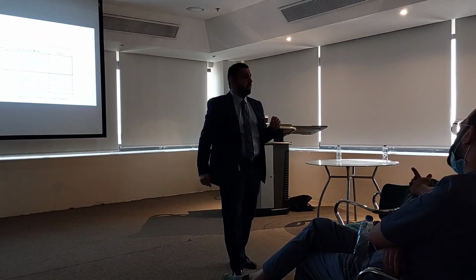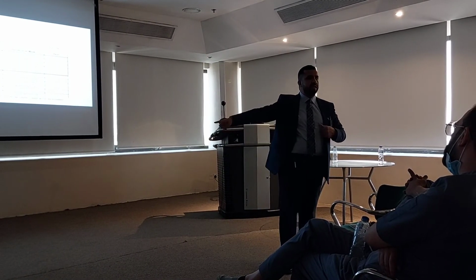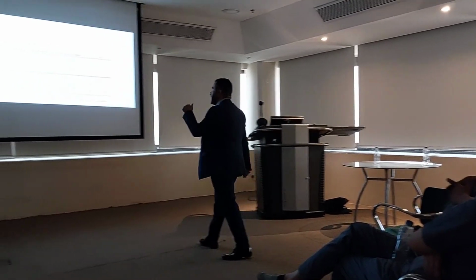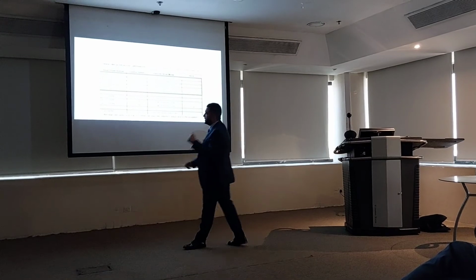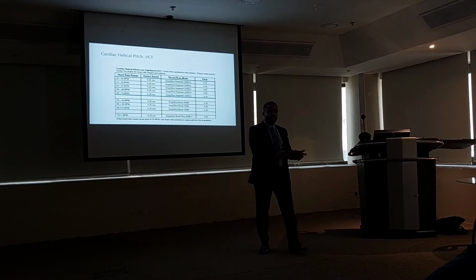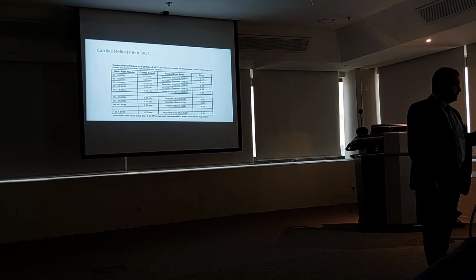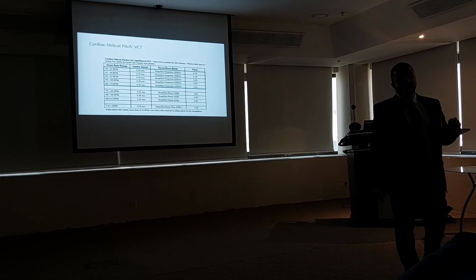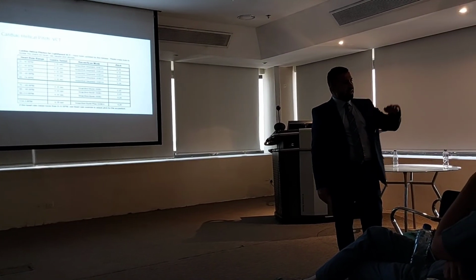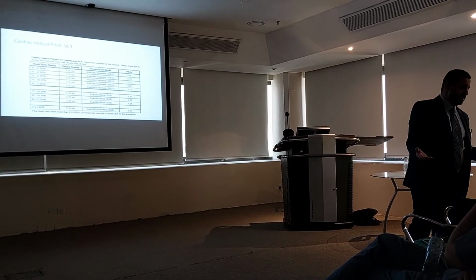The moment I click on confirm, it will check the heart rate and decide the pitch. If I click without asking the patient to hold breath, it will consider this is 78 beats per minute, the patient heart rate, and give the pitch for that. So I have to tell the patient, take a breath and hold. I will wait for the heart rate to get to 70, and then I will confirm and let the patient breathe normally.